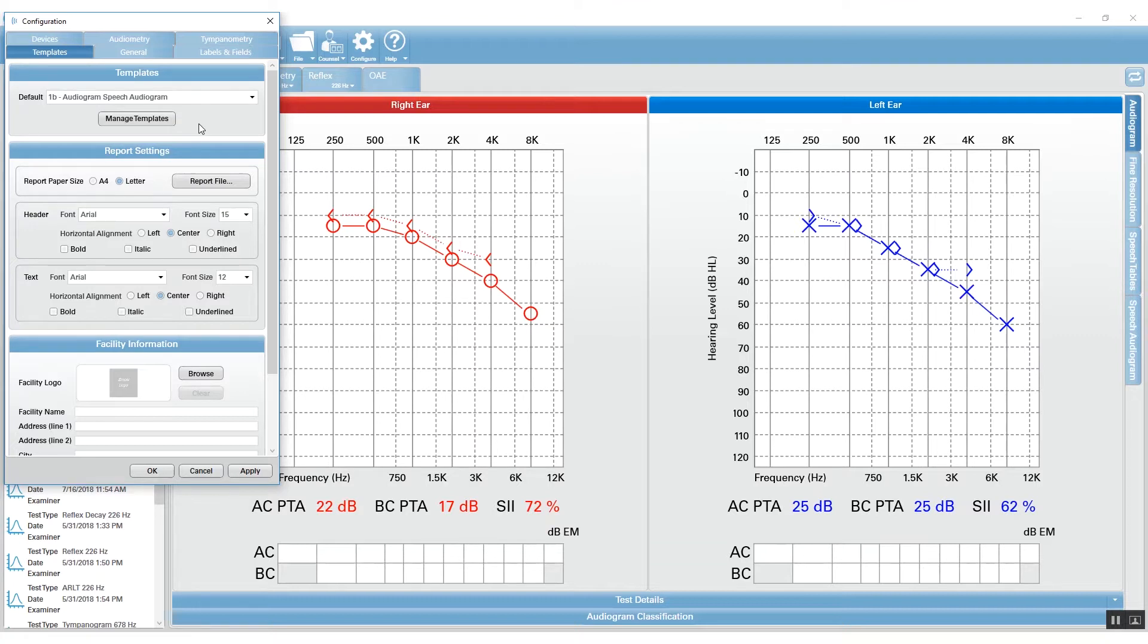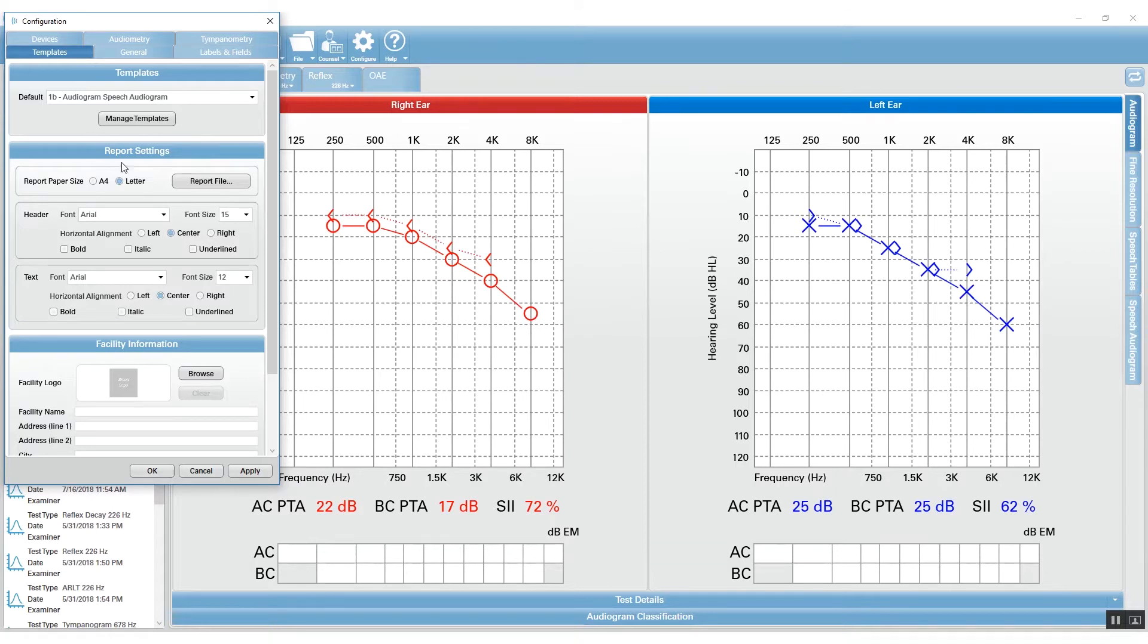You can either use one of those templates, modify one, or create your own. The next section handles reports and is called Report Settings. Here you can choose your paper size and whether you'd like to save directly to a file or print to file.